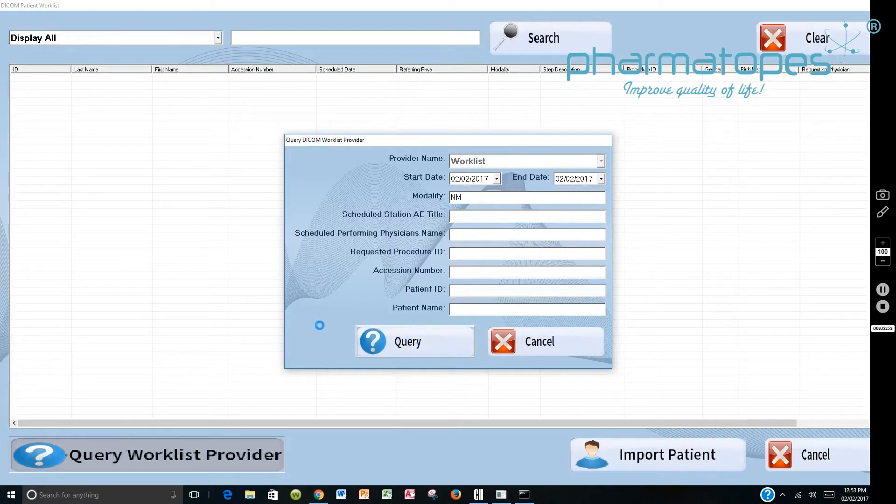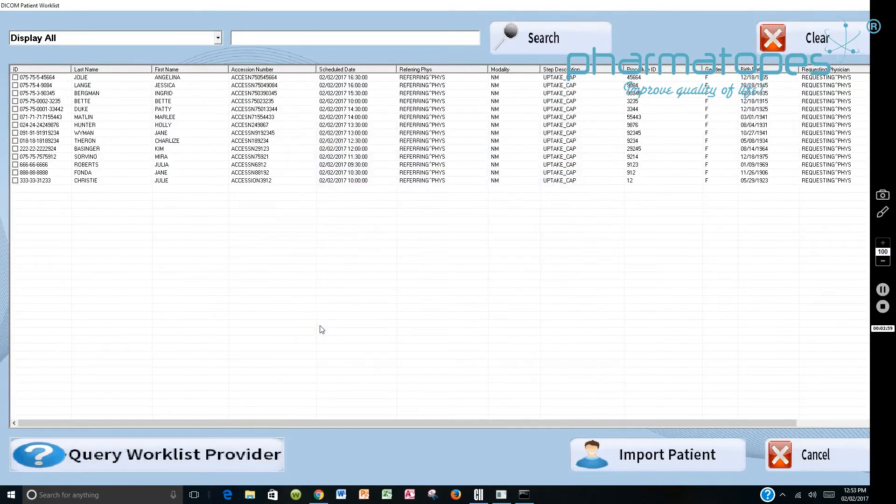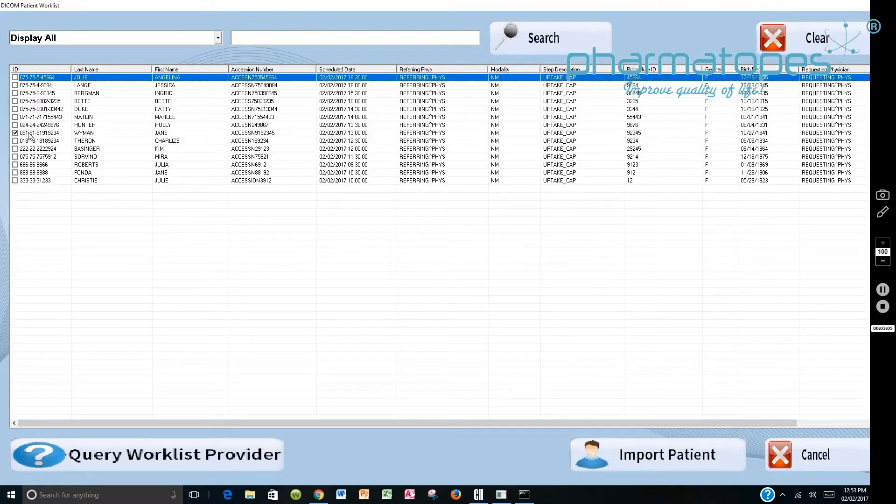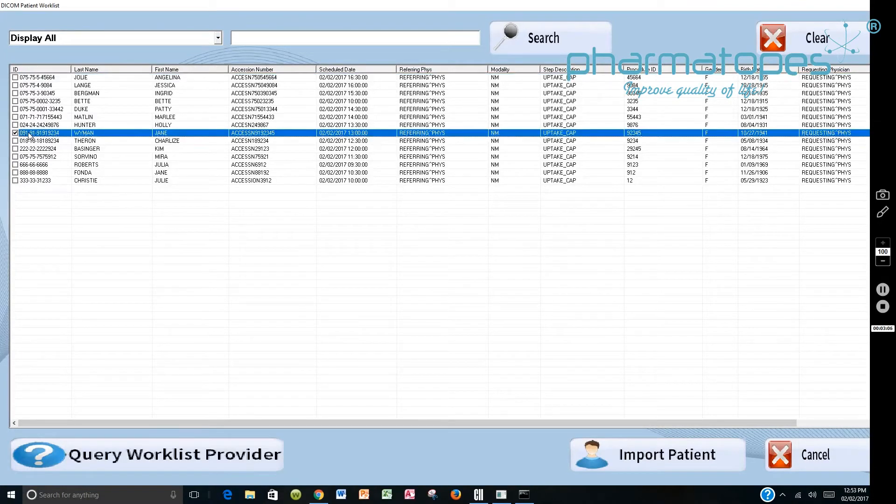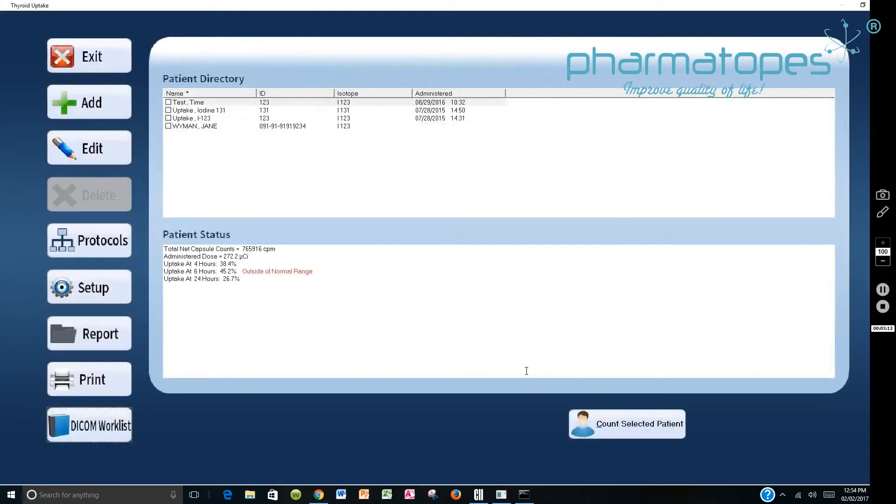It's going to come back to us and say these are the patients that are currently on the Worklist that can be accessed today. Then we would go in and we would select a patient. In this case we'll select Jane Wyman. We will say Import that patient. You've got to highlight it and put a checkmark. Import the patient. It goes into the patient directory.